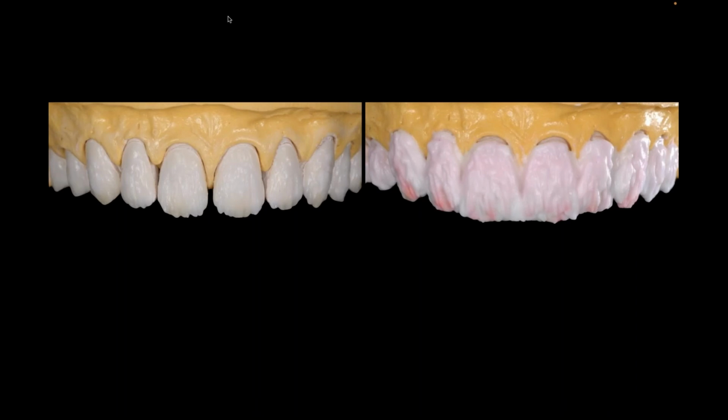You know, a simple way to think of this is when you're working in lithium disilicate, the doctor asks you for an A1 shade. How often do you actually pick the A1 ingot? And I hope your answer is never. You should almost always be choosing an ingot of higher value, B1, BL3, whatever system you're using. Well, it's the same here. When I'm looking at the cases and I want to achieve that A1 or that 1M1, right away my brain goes to, I need to bump up that value internally. I have to get something brighter to start with because I'm going to lose it when I start to filter that out with my enamel systems.